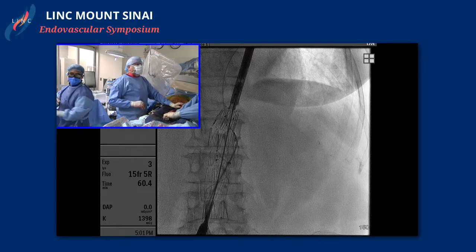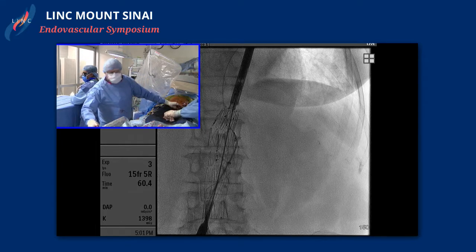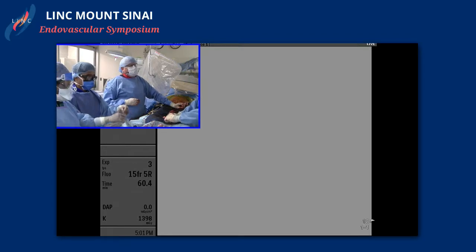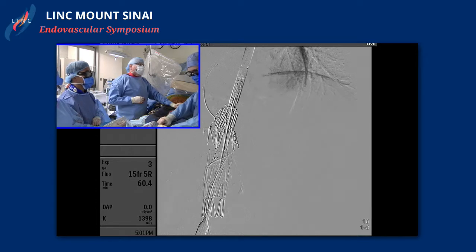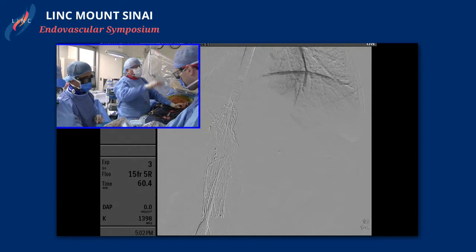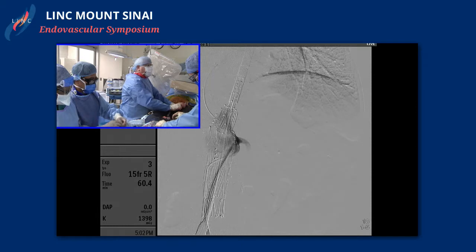At least you look like you're through the fenestration here. Yes, we're outside the graft now. We know — we can play our last run back. Sean, can you play the last run back? You can see it's a tease — we're dancing right at the door. I think we had two shelves: one shelf right there at the renal, one right below that wire, and then a shelf right at the bottom of the graft too, because we had to flip over and then flip back into that.